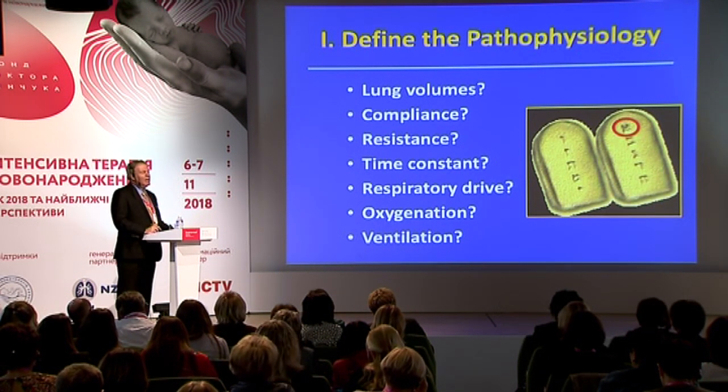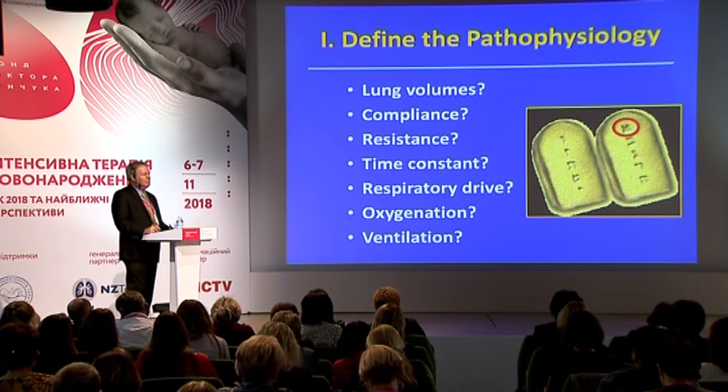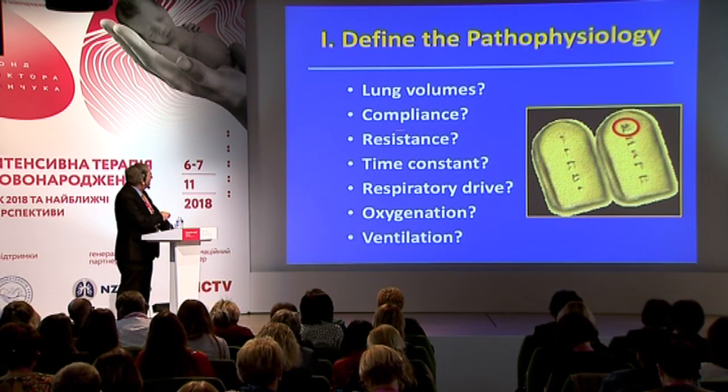Secondly, what are the mechanical properties of the lung? I asked myself, what is the baby's pulmonary compliance? Remember that compliance refers to how much of a change in volume you get when you increase the amount of pressure. So if the compliance is low, the lungs are going to feel stiff. If the compliance is high, it will be very easy to see chest expansion when you apply positive pressure ventilation.